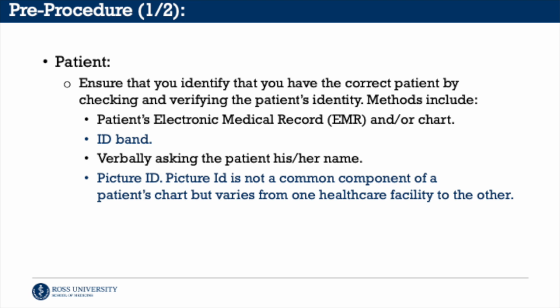For the patient-specific pre-procedure component, ensure that you have the correct patient by verifying their identity. You can do this with the EMR, the ID band, verbally asking their name, and confirming with the picture ID as well.